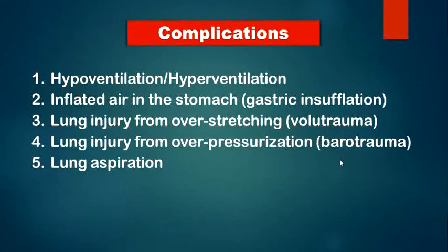Lung aspiration, and we talked about why it happens, because of gastric distension or a full stomach. Air embolism, yes, sometimes air may come inside the circulation because of the high pressure, causing air embolism, and we know the dangers of air embolism.